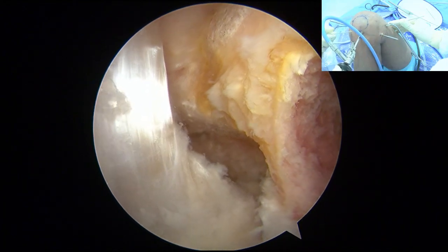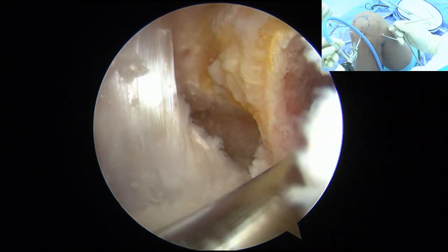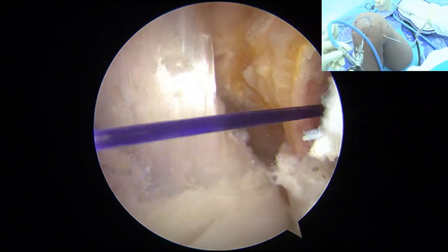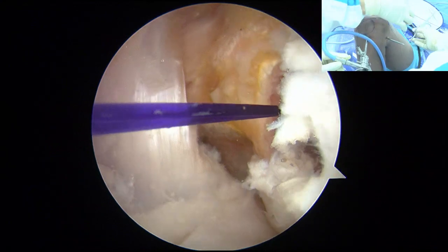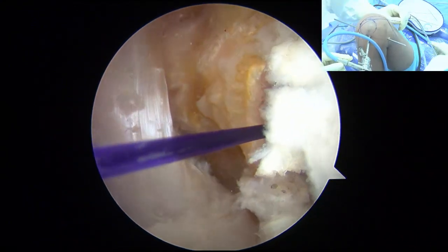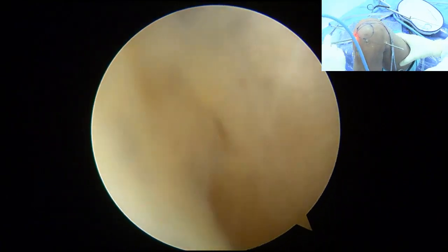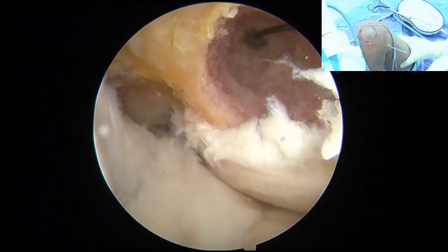So next step is we pass the purple sutures into the tunnel. Go. 那接下来把紫线带进隧道。 Yeah, so now we finish our femoral tunnel, okay? 现在股骨侧隧道的 So, look back to the medial side again. 可以了。 You look that really nice, right?